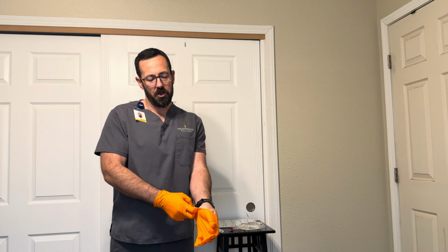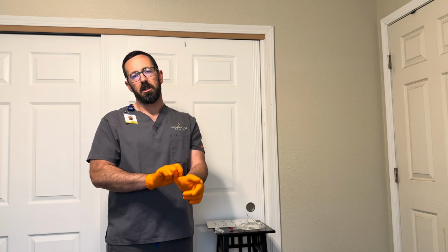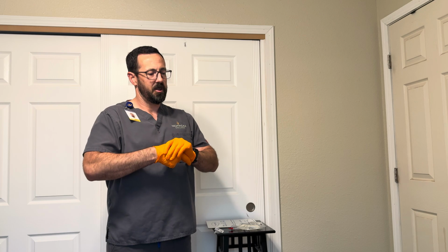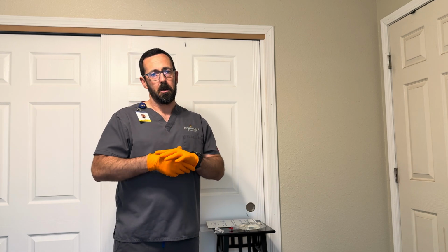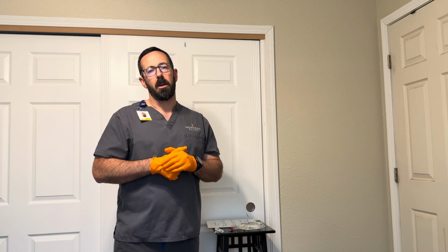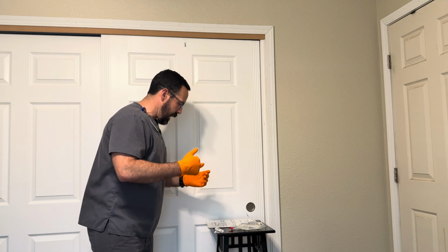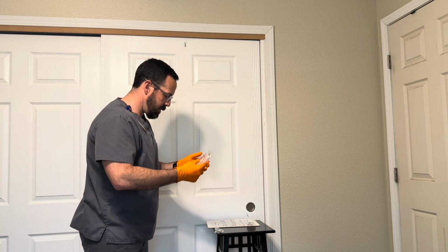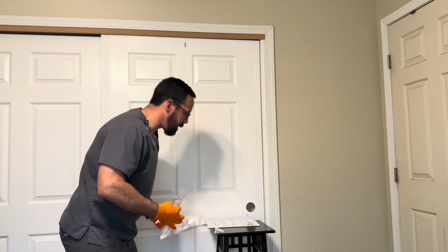After I've checked my 6 rights, I'm also going to verify that the patient does not have any allergies, especially to amoxicillin, because that's what we're administering today. And then also educate the patient on what the amoxicillin is for, and side effects of amoxicillin as well. So I have my IV fluids, and I have my IV tubing.